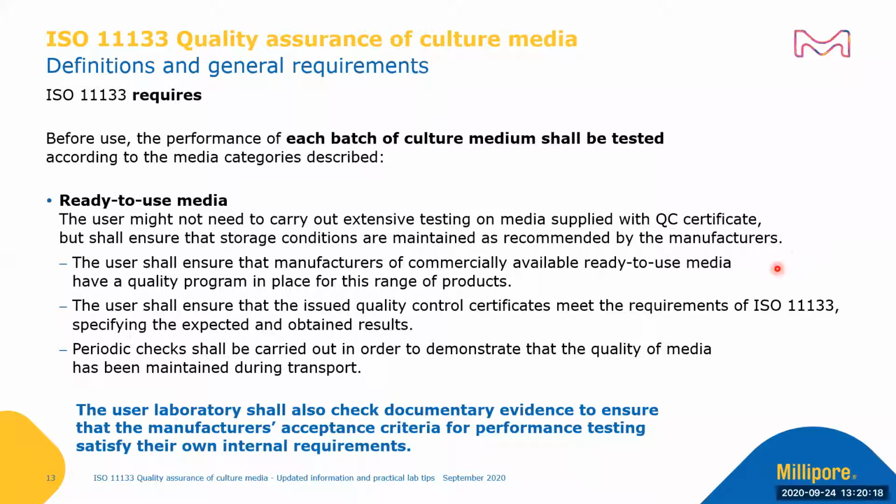The user shall ensure that manufacturers of commercially available ready-to-use media have a quality program in place for this range of product. The user shall ensure that the issued quality control certificate meets the requirements of ISO 11133, specifying the expected and obtained results.